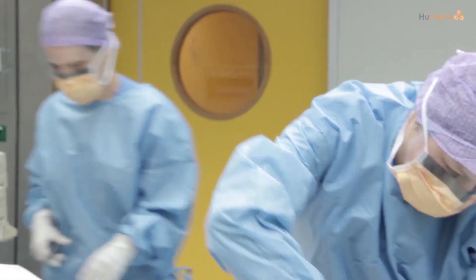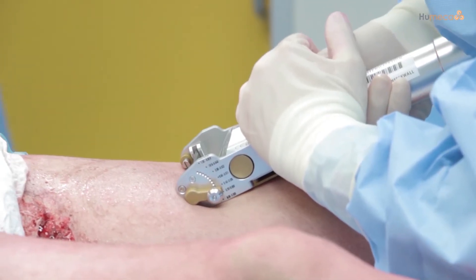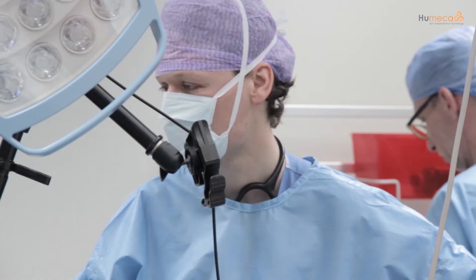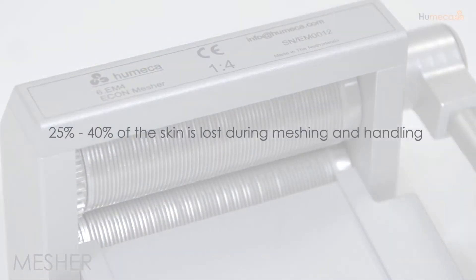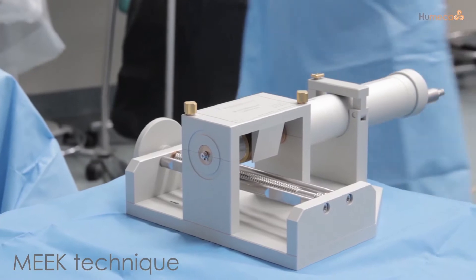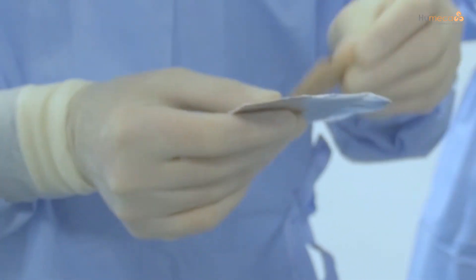All burn surgeons worldwide face the same problems in treating severe burn wounds, such as limited donor sites and difficulty in handling widely meshed skin grafts, especially when expansion ratios of one to three and higher are required. The expansion ratios of these mesh grafts are not realistic because 25% to 40% is lost during meshing and handling. We are proud to be the exclusive supplier of the modified Meek technique, the solution to all of these problems.